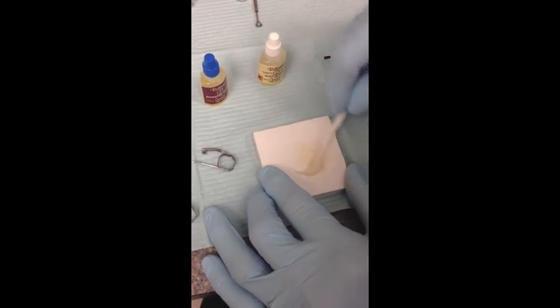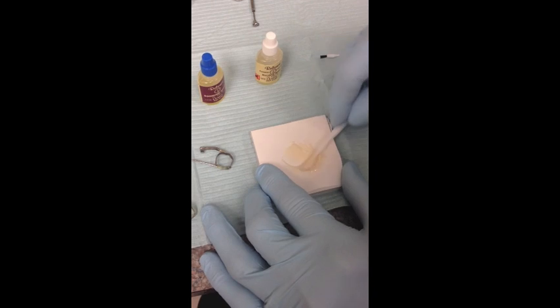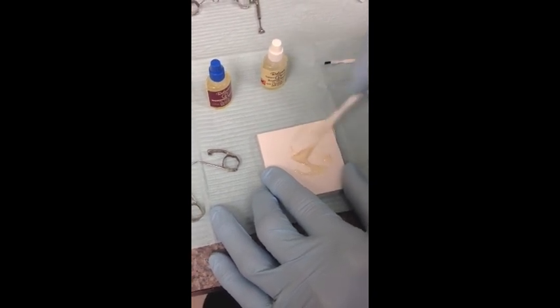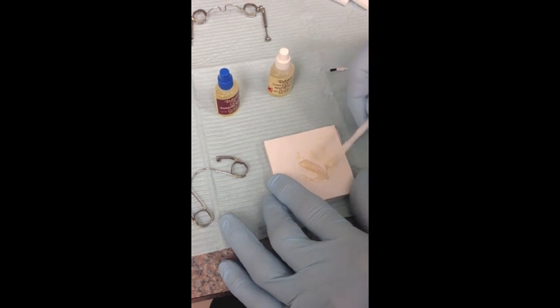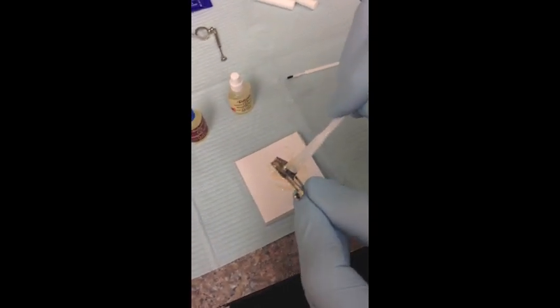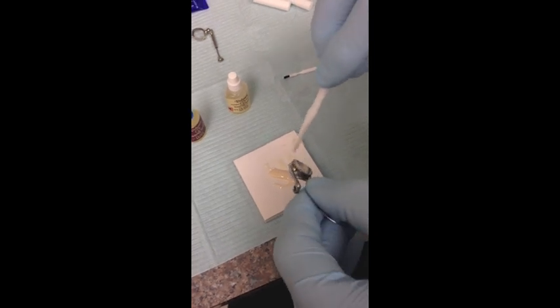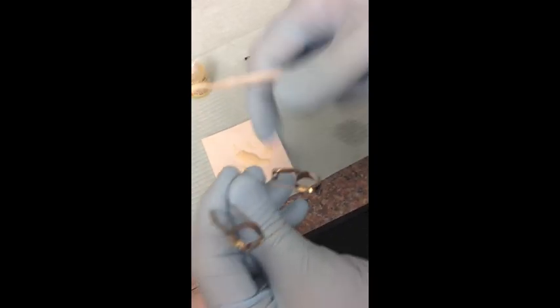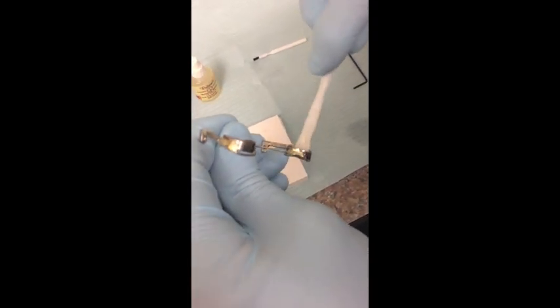This is just for the lower part — this goes into the bands. This is your cement, and we're going to repeat the exact same thing up top. To load it up — you don't need a lot in here, you just need to coat the inside of the band. You don't have to have tons of excess coming out everywhere. Just get a nice even coat.